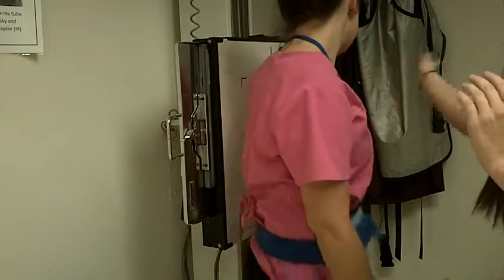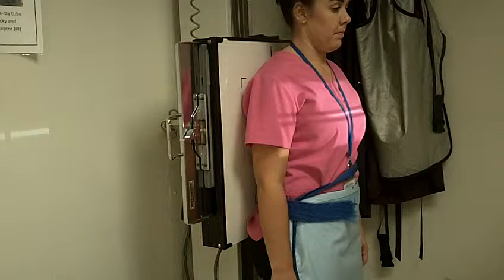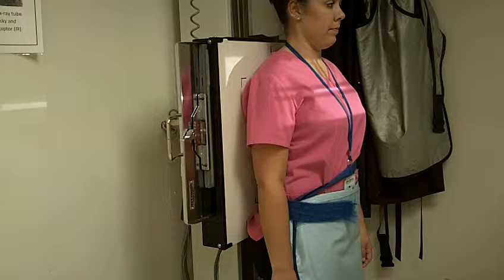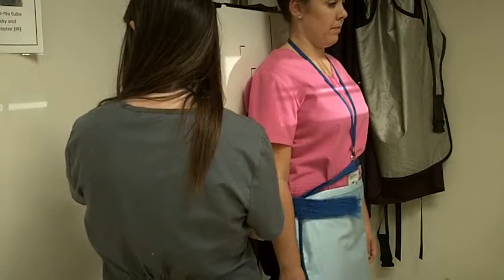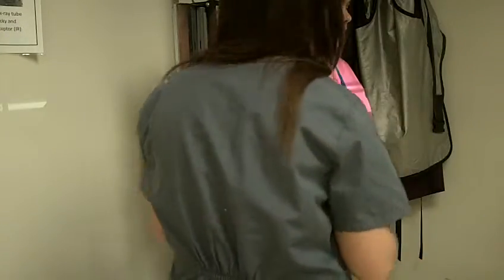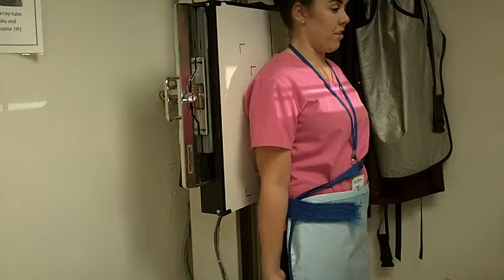Now you can go ahead and put your back against the board here. So how's your day going? Pretty good. Just about ready to go home for the evening here soon. Go home and relax? Hopefully. Not really — a lot of homework and stuff.